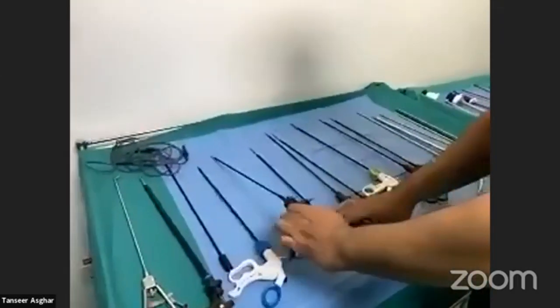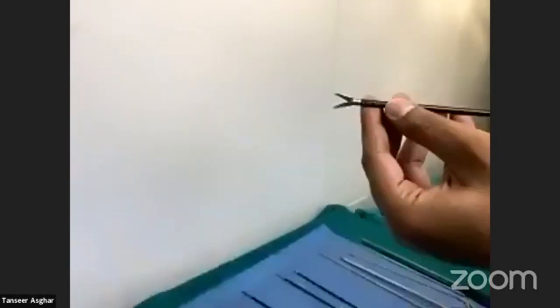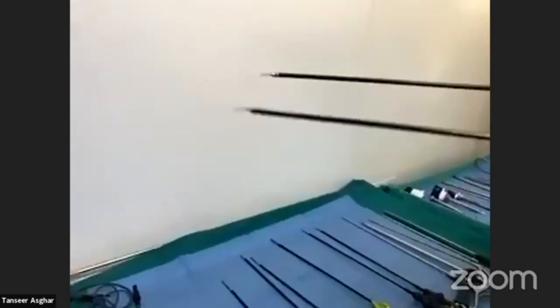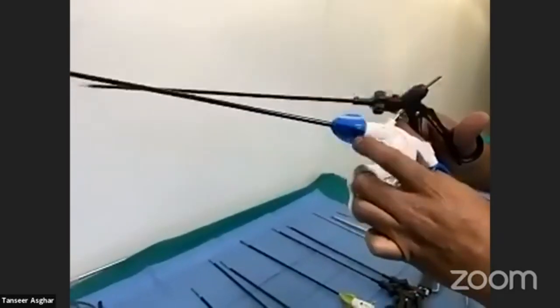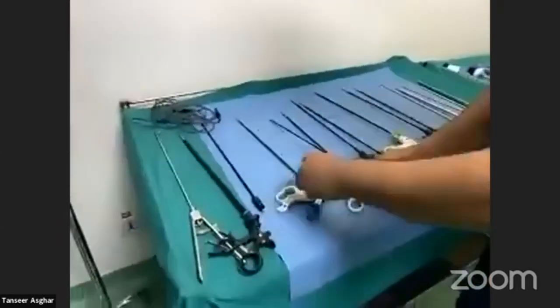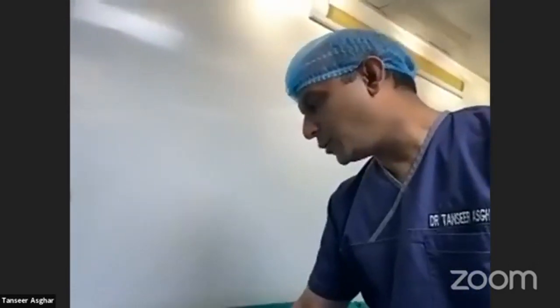This is an endo-scissors. The scissors also come with different tip shapes — some are curved, some are straight. One is a reusable instrument and one is disposable. Both have rotating heads and attachment points for cautery. They are used for cutting structures such as the cystic duct, the base of the appendix, or bowel.